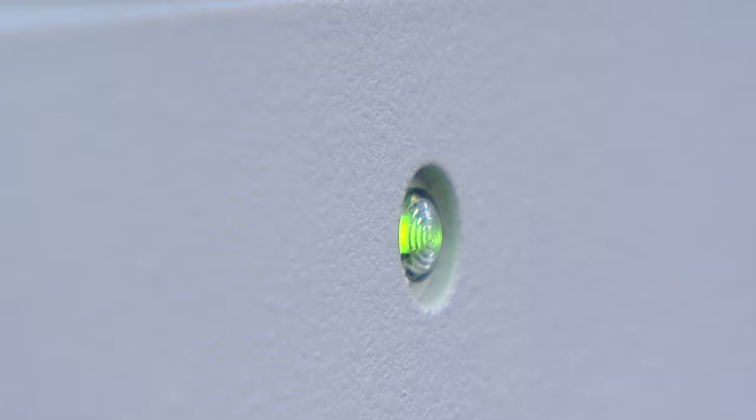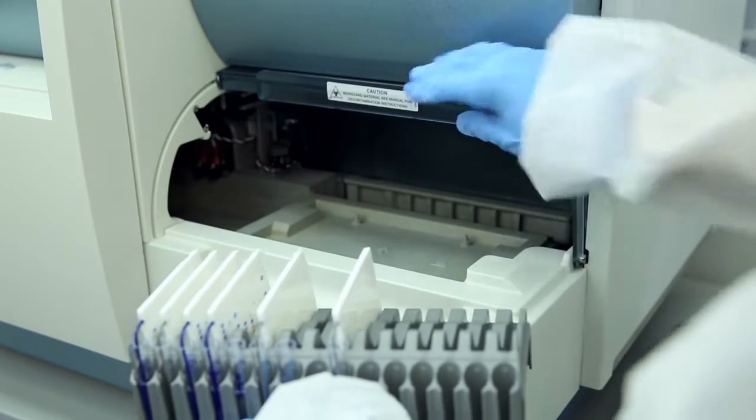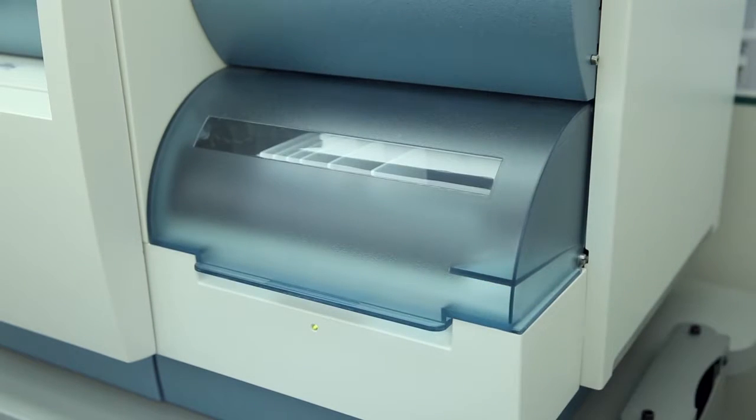A steady green light indicates a cassette can be loaded. Load the cassette into the Vitek2 instrument within 30 minutes of preparing the first inoculum. It is very important that suspensions do not sit for more than 30 minutes prior to card inoculation.